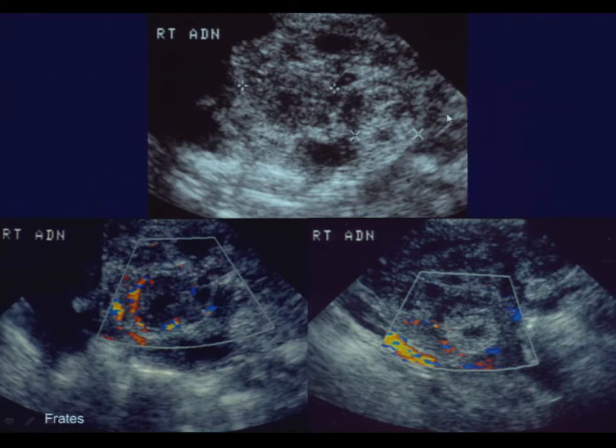I just had a very large mass, and I thought, wow, the ovary has to be in there somewhere. How am I going to find it? I could find two round structures, this hypoechoic ring and this more echogenic process. Turned on color Doppler, and you can see this hypoechoic ring has the ring of fire around it that we typically see with a corpus luteum, and a little bit of flow around the echogenic mass, but not the dramatic flow that you see in a corpus luteum.